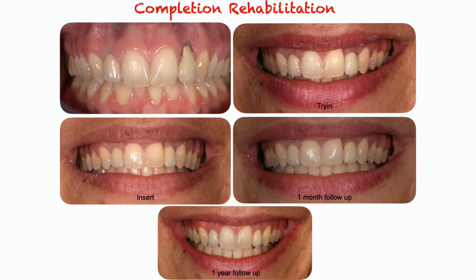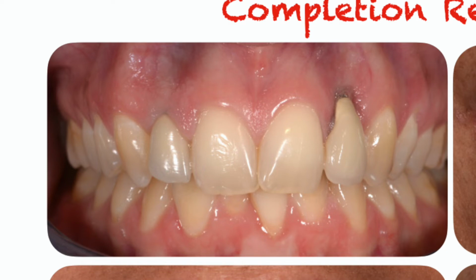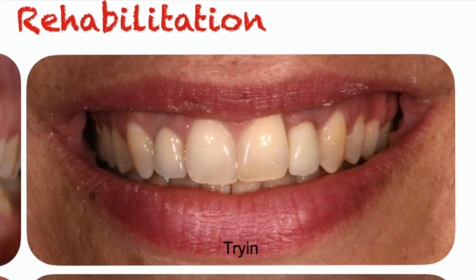This is how the patient started almost 2 years ago now. And all these factors, we have overlap, we have inadequate space. Look at the root emergence, the eminence here. It's inadequate. So this is why Hamid had to do all that site development to make a nice eminence. Okay, that's a try-in. I didn't like that. And it looks okay, but it's inadequate. I want a long contact area, but I thought the tooth looked too rectangular to me. So I sent it back.